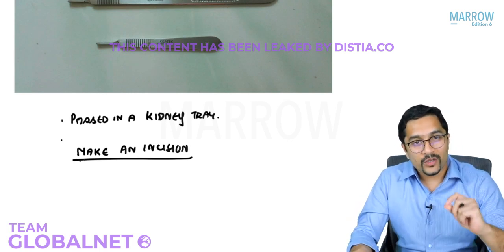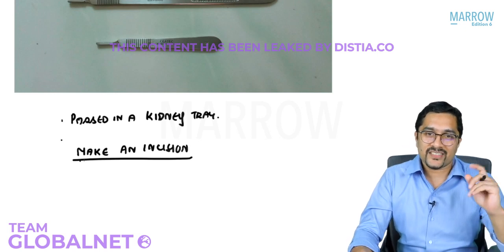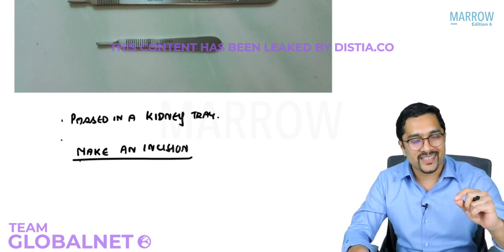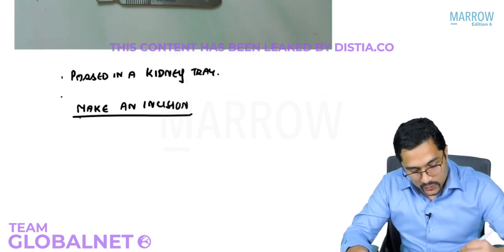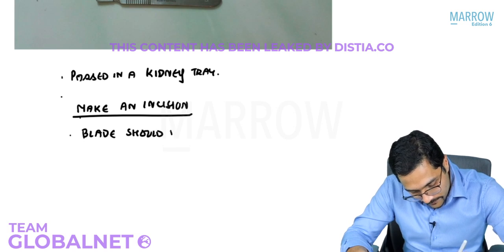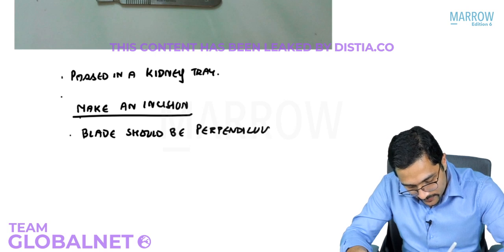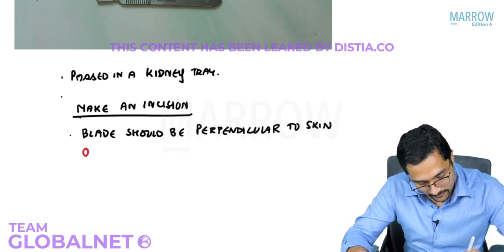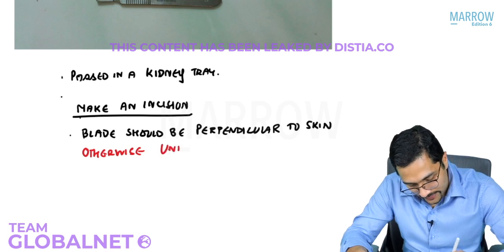And you have a lot of old-timer faculties in surgery who are very particular about this point, that we always make an incision. Now, to make an incision, the blade should be perpendicular to the skin. Otherwise, we can land up with undermined or beveled edges, and we don't want that.